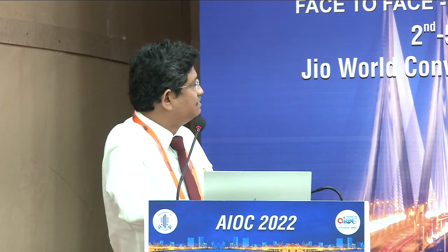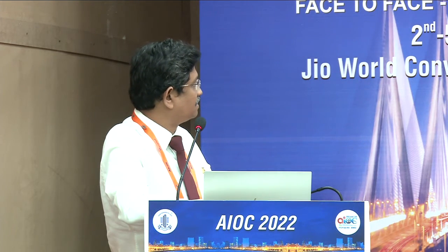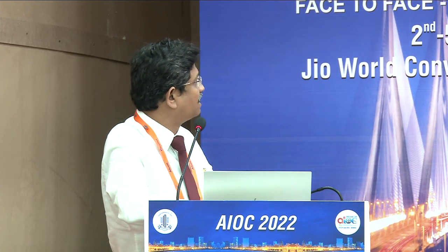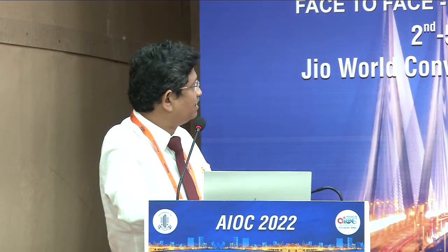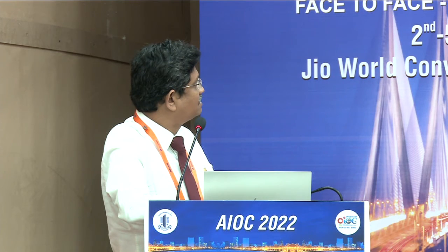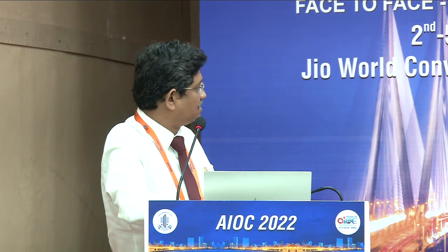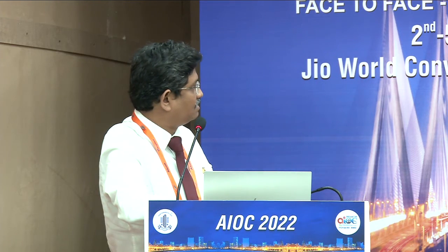And if you see, this is a normal MFERG. This is MFERG in a classic ILM peeling technique and closed macular hole. And this is where an ILM free flap has been put. And this is your graft. So if you see them in one place, this is a normal one, this is a classic peeling, this is a re-peeling and ILM plugging, and this is a grafting. That's what can be seen in one chart.